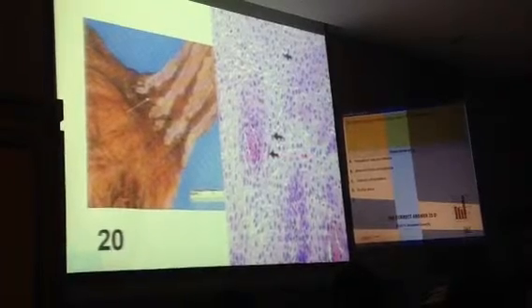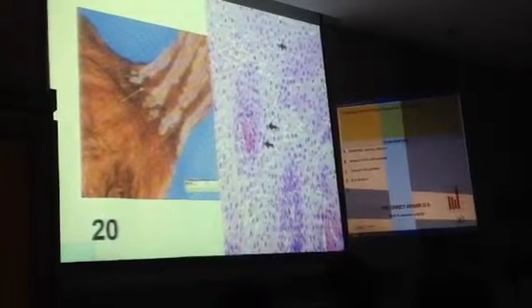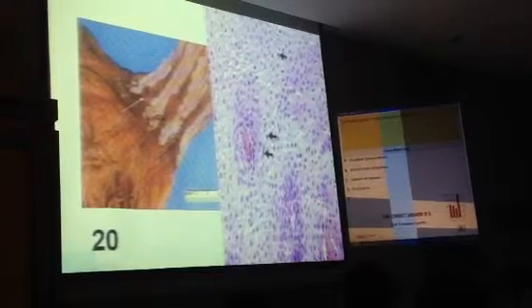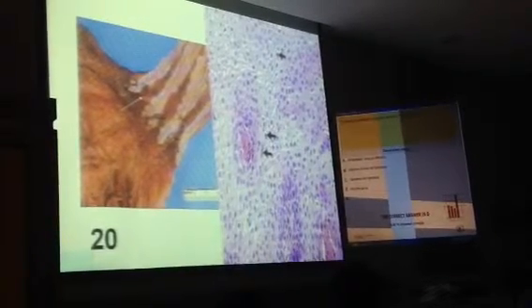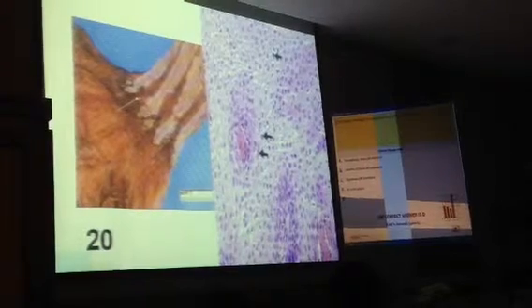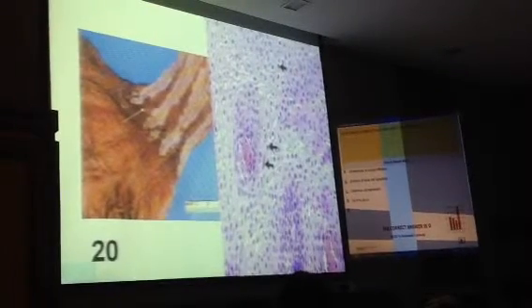That's correct. Check. And then part of the response is to increase in number. So there is squamous cell hyperplasia, and the reason why there is basal cell hyperplasia is the basal cells are the reserve cells that give rise to the population of mature squamous cells. So you see basal reserve cells, squamous cells, and intraepithelial leukocytic infiltration, allowing for a thickened mucosa of the squamous lining.